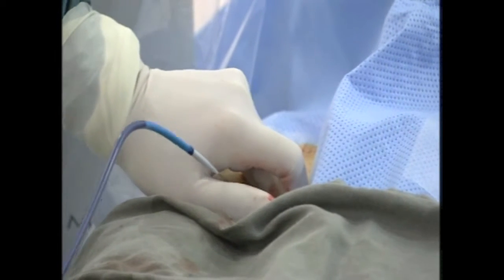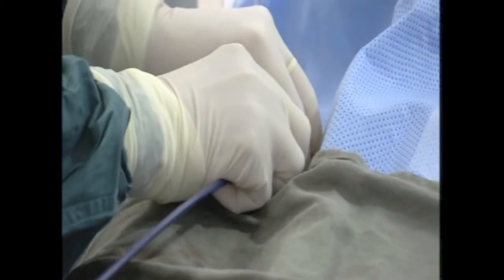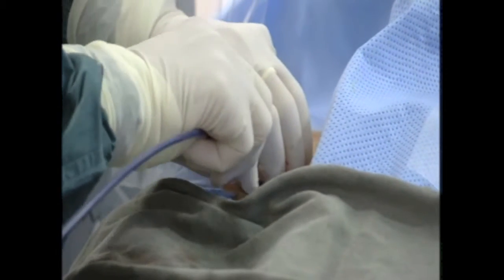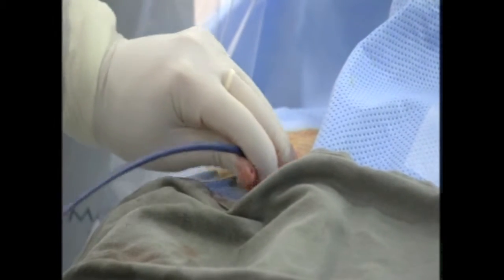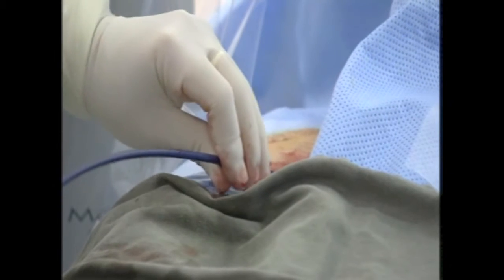So yes, we puncture inferior and posteriorly, but when there is a PFO, I usually try to go through the PFO first. And only if I see that the position of the sheath is not optimal, then I do a puncture at the inferior side of the septum.